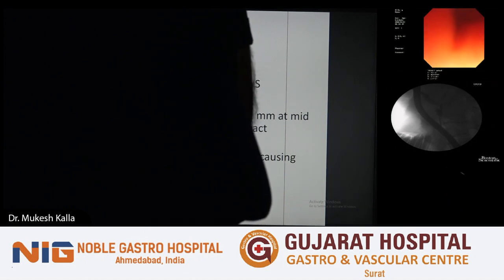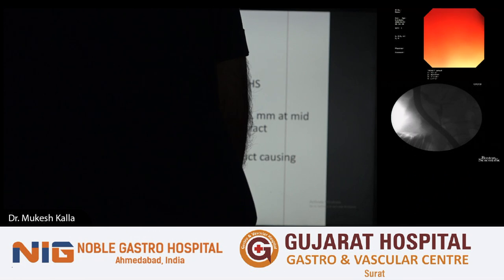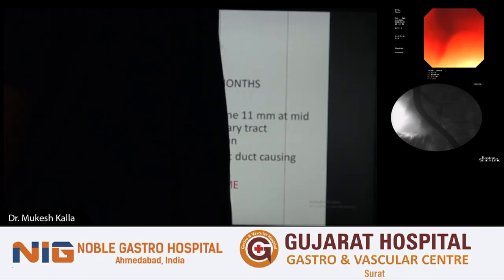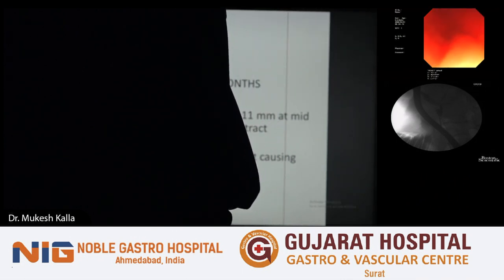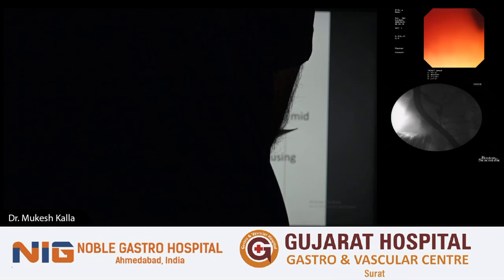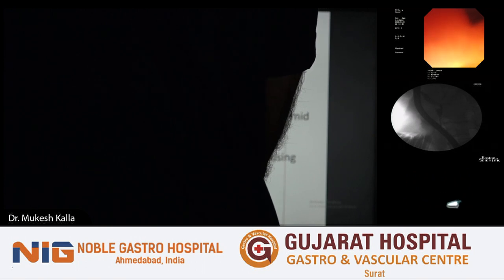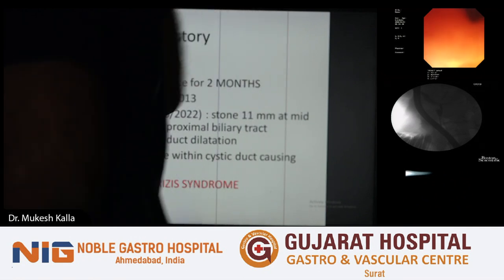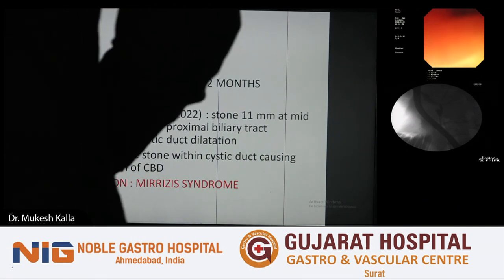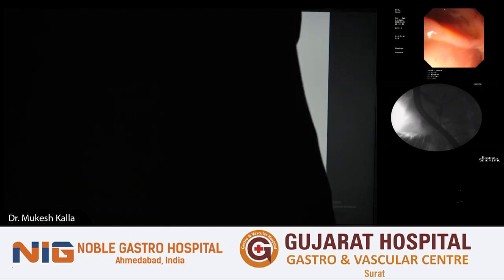See, the biggest misconception is that you can dilate the CBD with a balloon dilatation. That is a misconception. By balloon dilation, what you are doing is just dilating the ampullary muscles. So you are not doing anything to the CBD. When the CBD is 10 and you are doing dilatation with 15, there are chances of complication. I've seen patients come to me with CBD perforation. That's not a wise idea. And don't think that you are doing a CBD dilatation. You are doing an ampullary dilation.